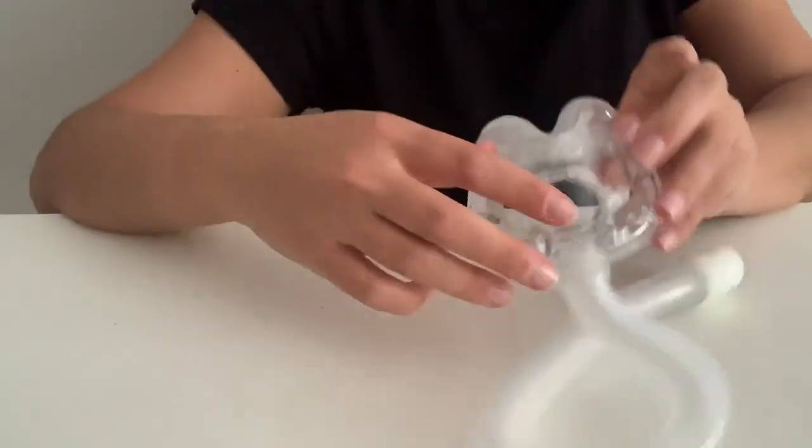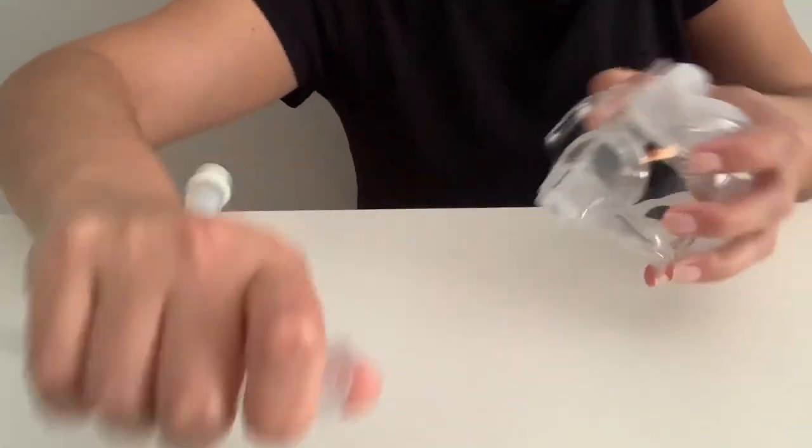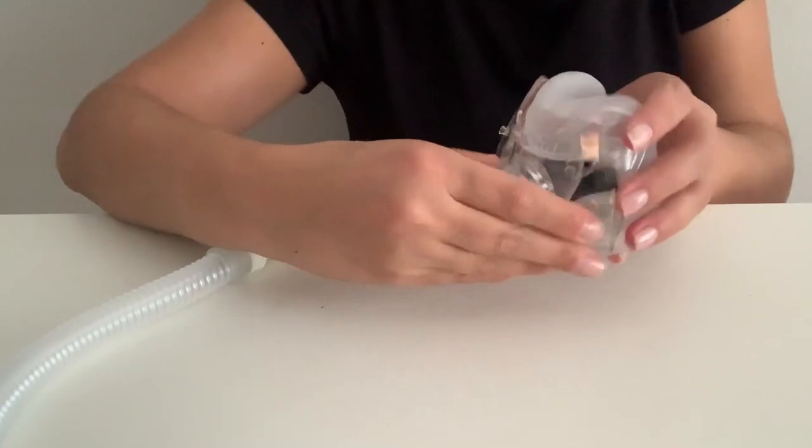Next, remove the tubing from the frame by pulling from the top of the tube. Then take the frame and push in where the head straps were to remove it from the cushion.